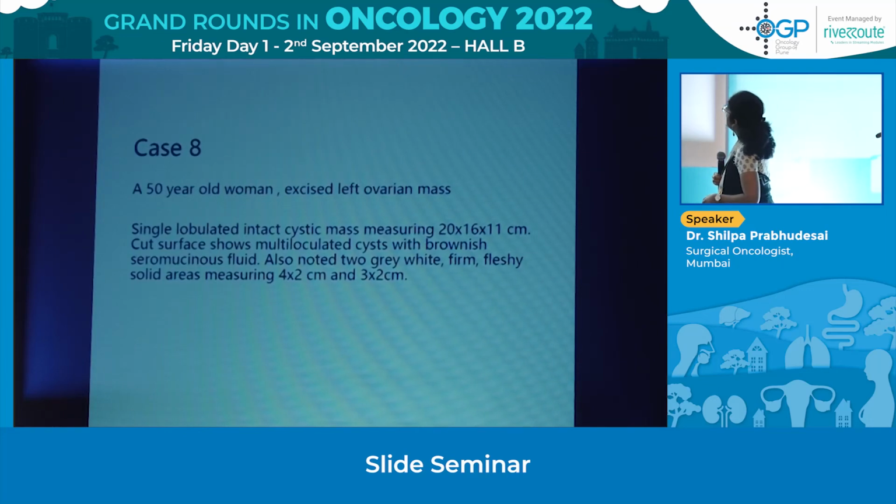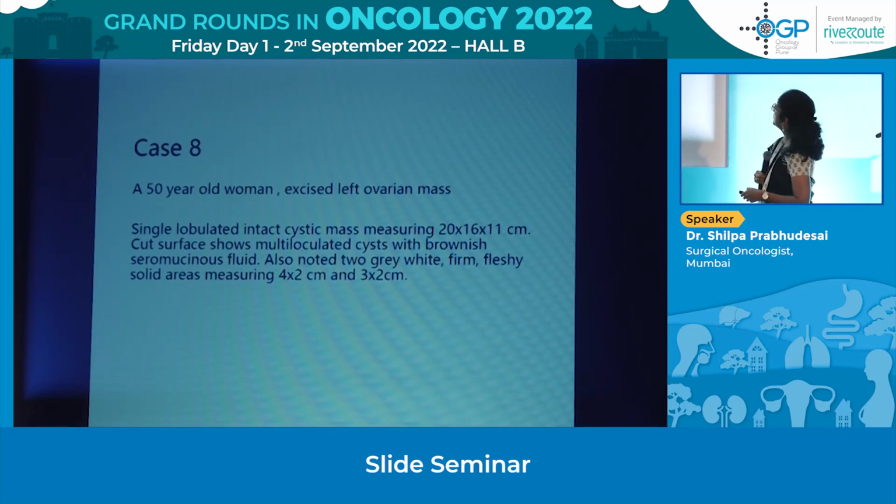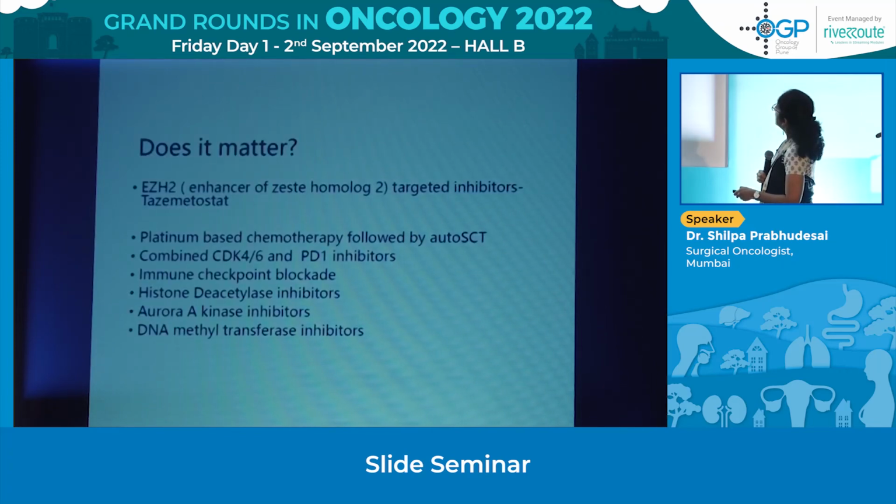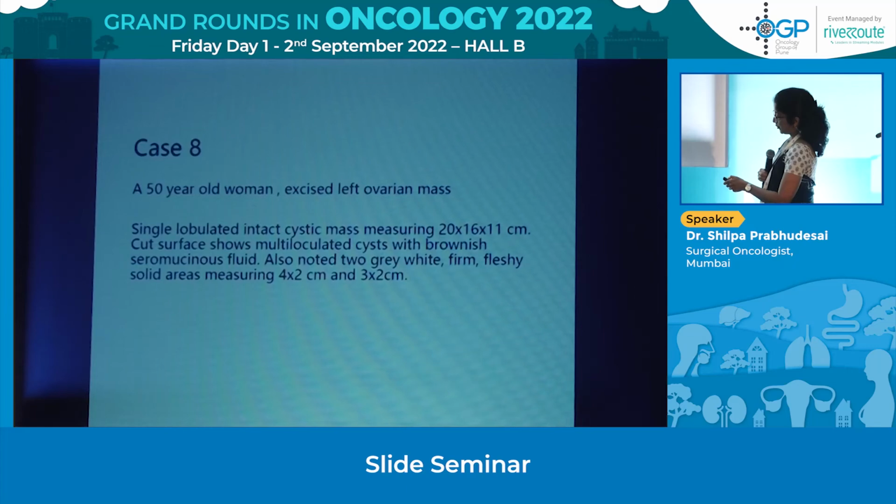And this is my last case, which is a 50-year-old woman whose left ovarian mass was excised. This was a large mass, 20 by 16 by 11 centimeters, with solid and cystic areas.